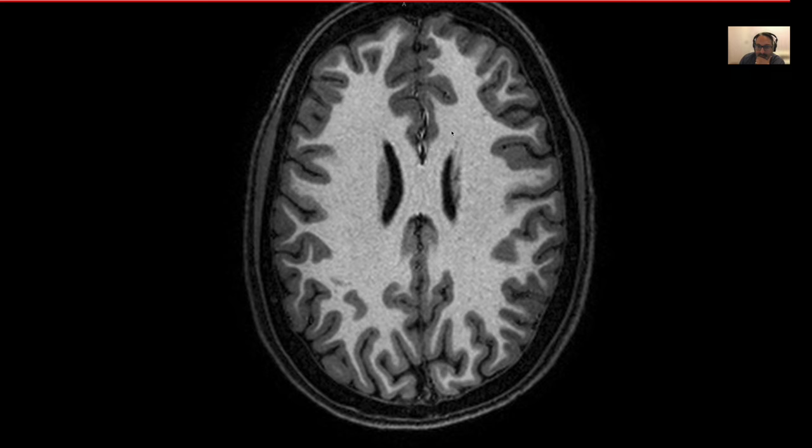This is the area where the two hemispheres meet. So the two hemispheres are not meeting here, they're not meeting here, but this is where the two hemispheres are meeting. And at this point, keep in mind that your superior sagittal sinus is also continuing. So you see two dark things here also, and these are the lateral ventricles. So this is where the lateral ventricles start to show up, and that's your anterior horn. And then as you go a bit more posterior, you're going to see the occipital horns show up also.